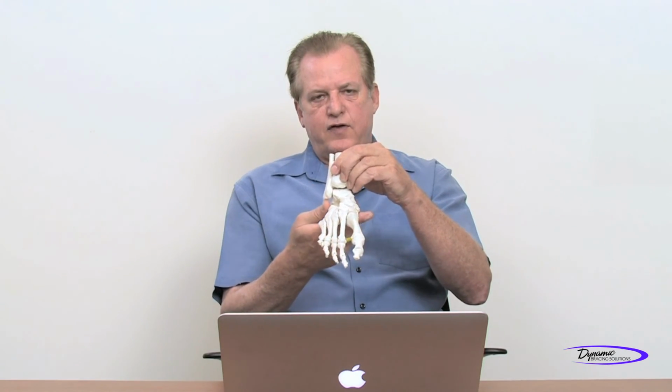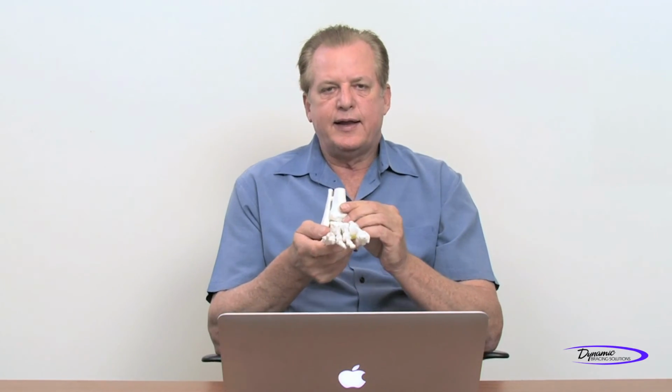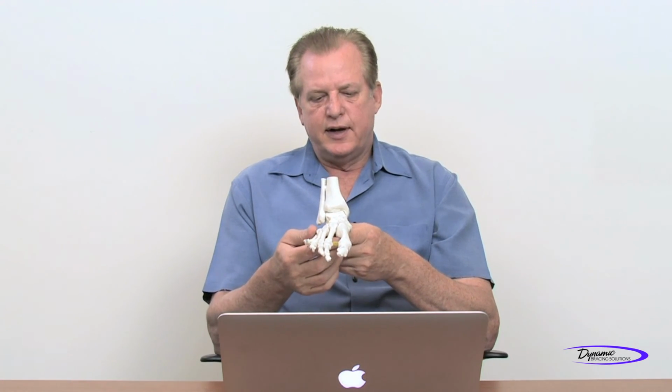We have the sagittal plane, which is everything that happens in this dimension. We have the frontal or coronal plane, which happens side to side. And then we have the transverse plane, which is rotary. I think most orthotic designs we're utilizing today assume that we are controlling those two other planes. In the sagittal plane, we take care of the drop foot, and we also try to protect the knee from buckling to the front. But really, very little is being done in the coronal and transverse planes. That's what I'd like to talk about further: we need to control in all three dimensions.